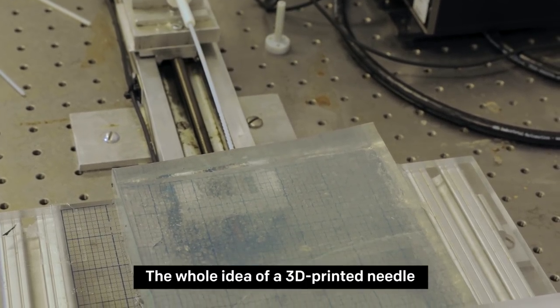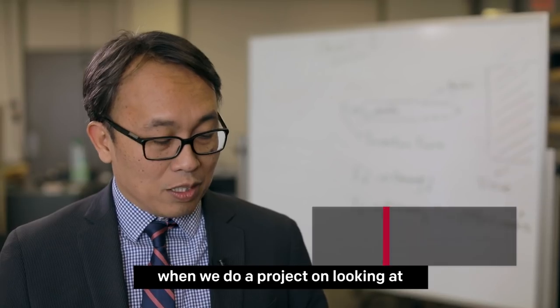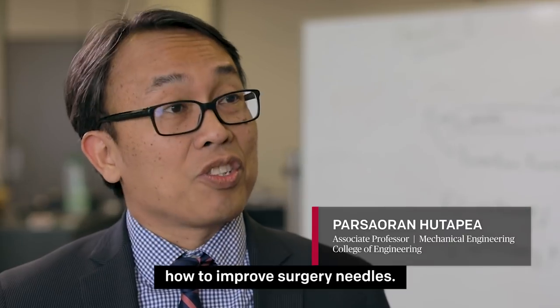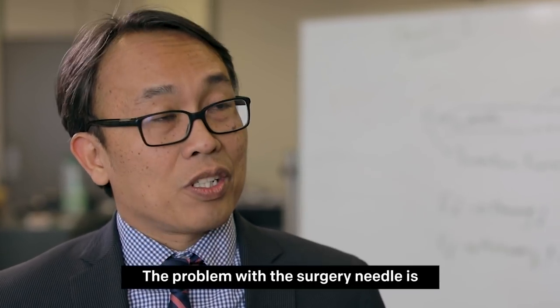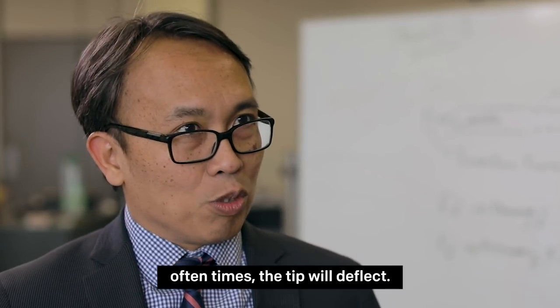The whole idea of a 3D printed needle came about six or seven years ago when we did a project on looking at how to improve surgery needles. The problem with the surgery needle is when you go into human tissue, often the tip will deflect.